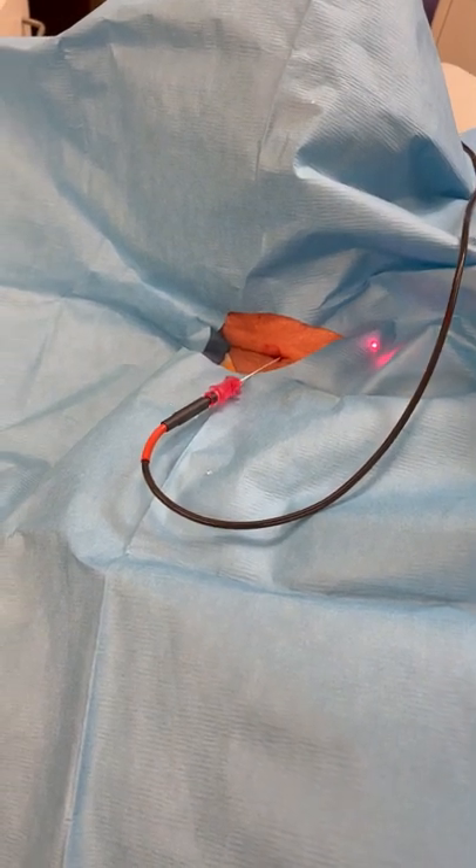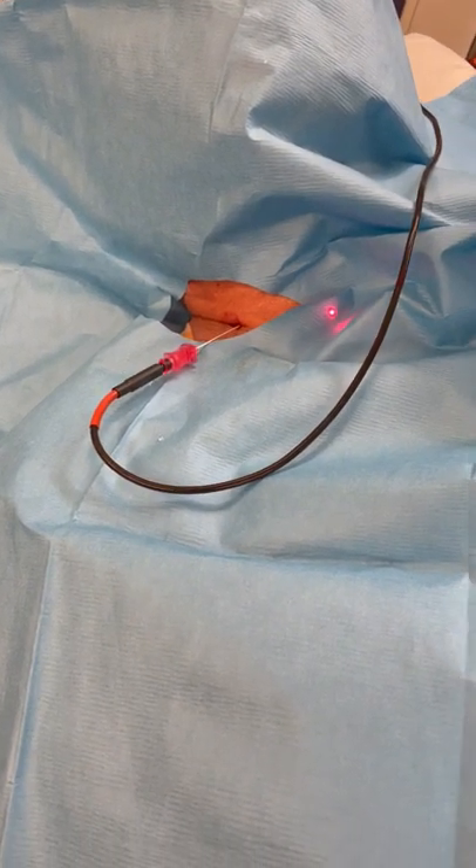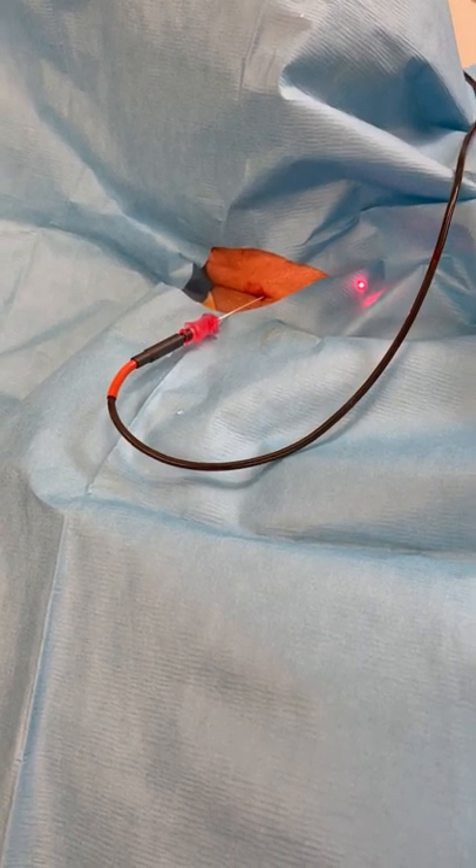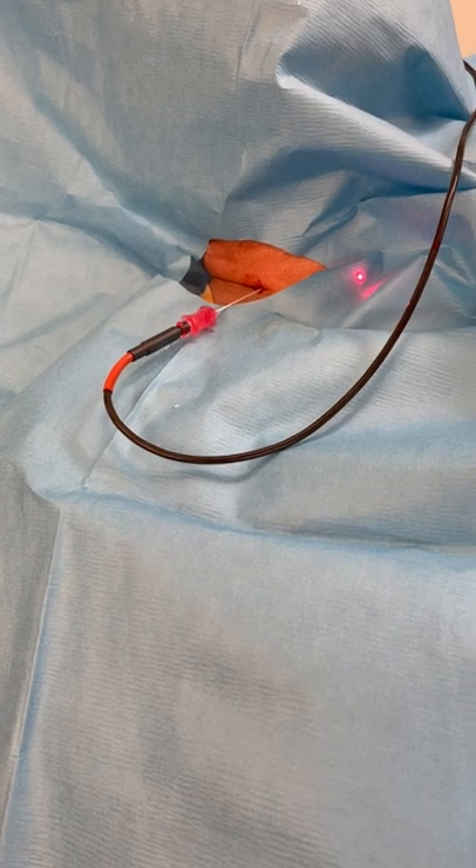This is pulsed radio frequency ablation. We're performing the ablation on the patient's right C5 and C6 nerves.